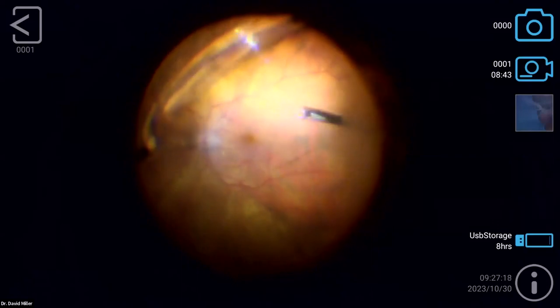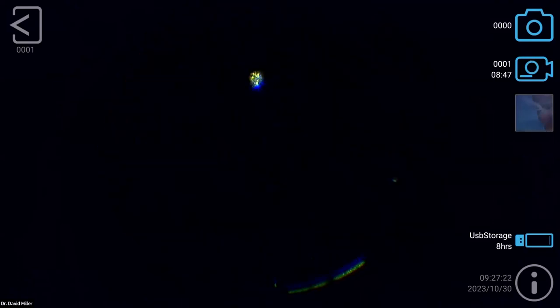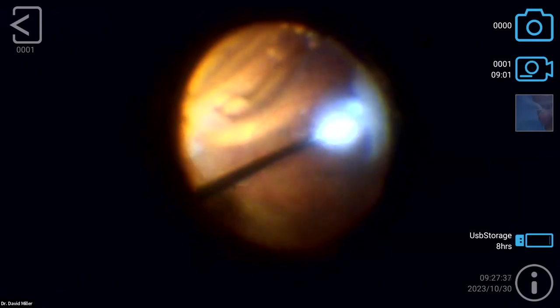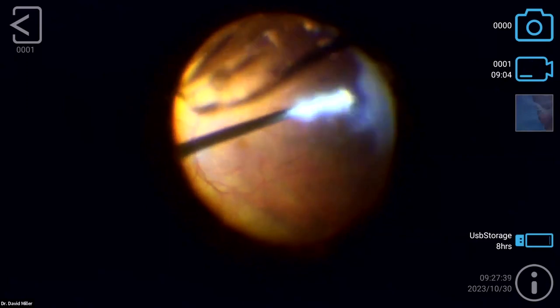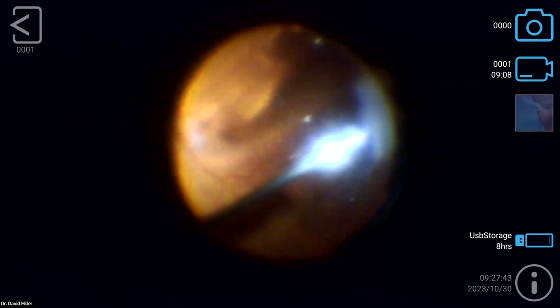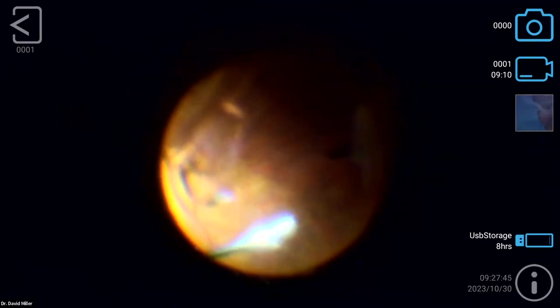We're going to switch hands here. We're fine, you don't have to move it. I always start my vitrectomy with the temporal hand. I always come back over to the other side because the vitreous can be a little more difficult to reach on the side you're on. So I come across. Again, this is a pseudophakic eye. This would be much more difficult in a phakic eye. Don't want to bump the lens.